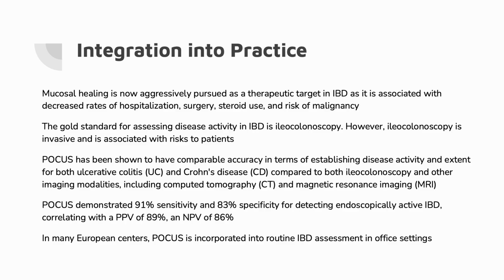So integration of POCUS into practice. Mucosal healing is now aggressively pursued as a therapeutic target in IBD, and it's associated with decreased rates of hospitalization, surgery, steroid use, and risk of malignancy. The normal gold standard for assessing disease with IBD patients is the ileocolonoscopy. However, ileocolonoscopy is invasive and associated with risks to patients.